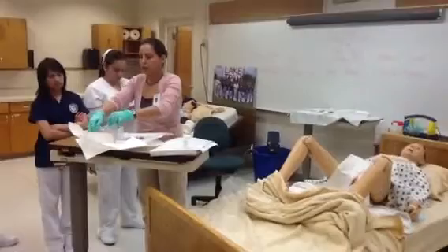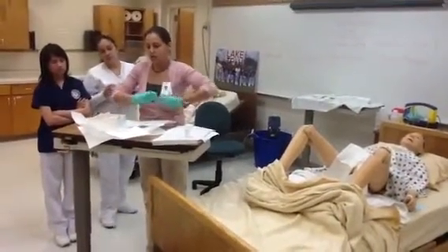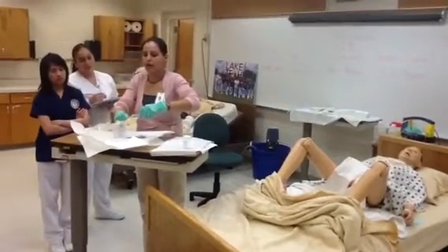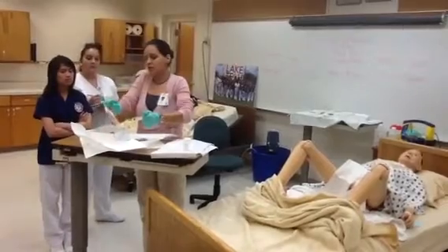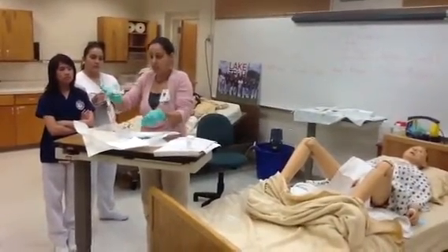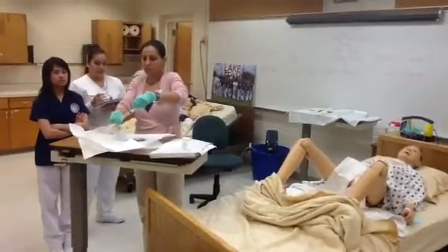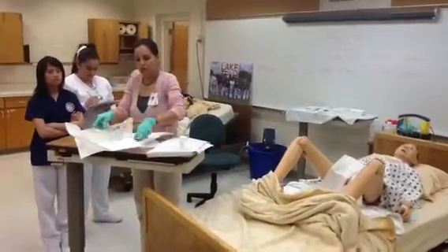All right, this particular packaging, number 6, says to go ahead and inflate the balloon with sterile water. This green port is where I attach my syringe. And you'll all notice that my balloon is not leaking, and it's doing okay here. So we'll go ahead and let that all down. And I'll leave this connected so that it's ready for me to inflate when I need it.